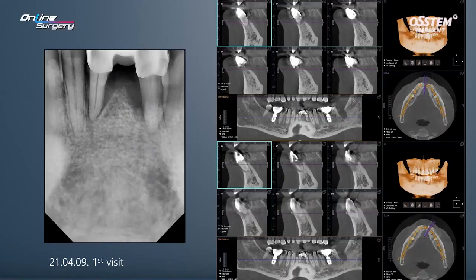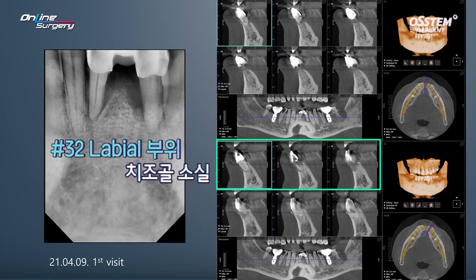If you look at the lower anterior area on the standard image, there's a lot of alveolar bone destruction. On CT, in the case of number 32, severe alveolar bone destruction can be observed. There is no labial bone left.